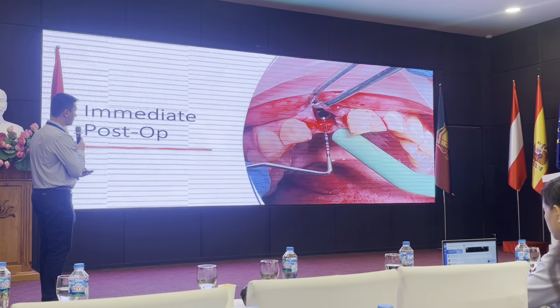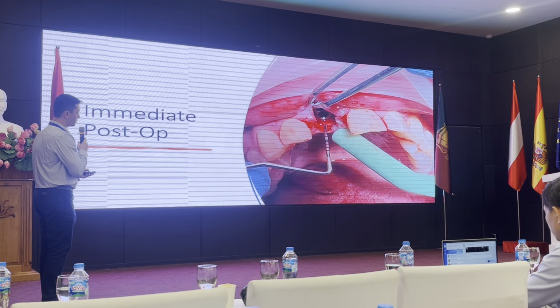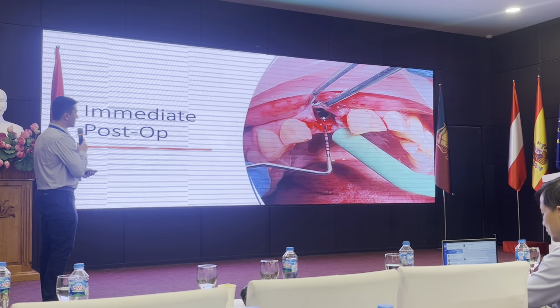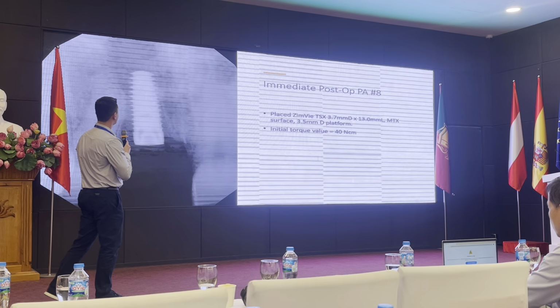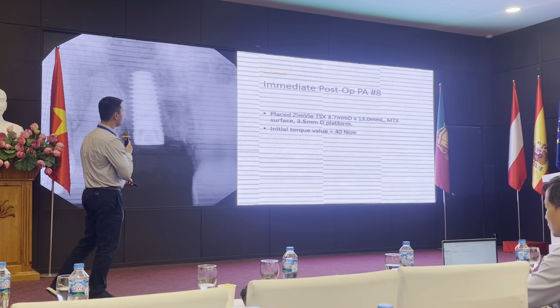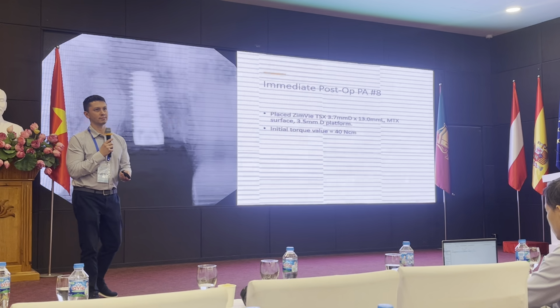And we evaluate where the implant is placed. We can see the perioprobe here. We can see where the palatal bone level is, and the implant is placed apical. And so we're just checking the depth of how deep the implant's placed. Take our radiograph, our torque. We got to 40 newtons on this implant. And this was all achieved because we had a guided surgery.